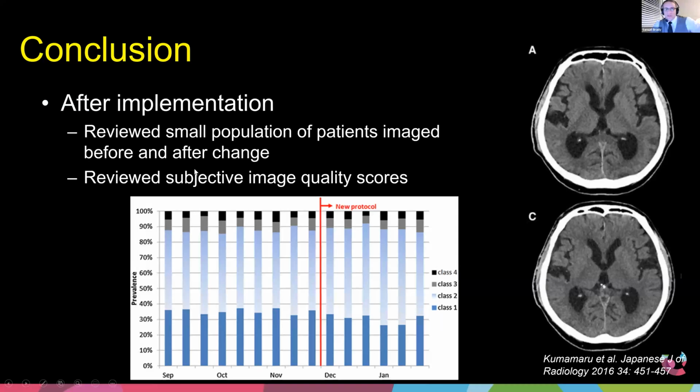And this is actually a great example of subjective quality scores. As I mentioned at the end of the last hour, there's really 3 ways to do this. There's the reader observer, or the subjective quality scoring. There's the mathematical reader observer, which, if you can, go for it. And then there's, at the minimum, which is none of this, what you're seeing here. It is at least the radiologist sitting at the CT scanner, making sure when the scan happens, the image looks good, or they're in the reading room, just paying attention to these as they come across.